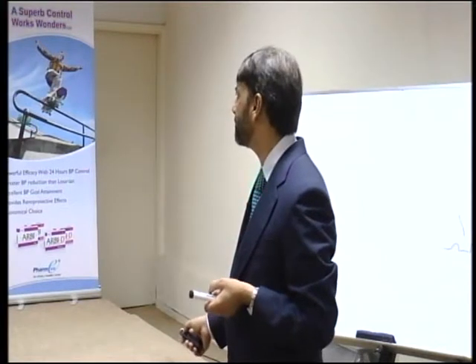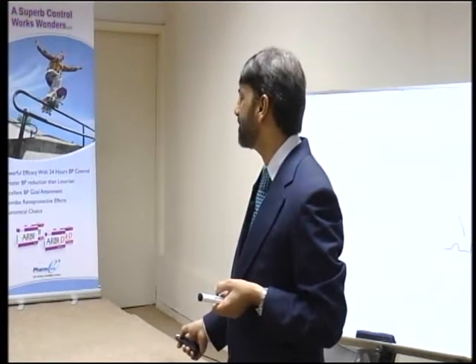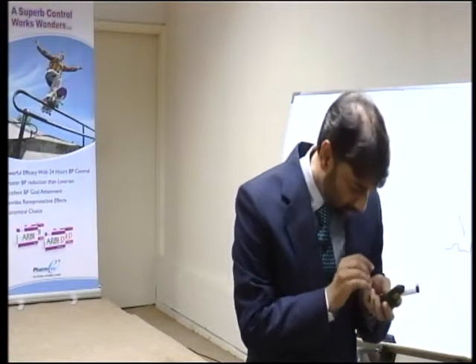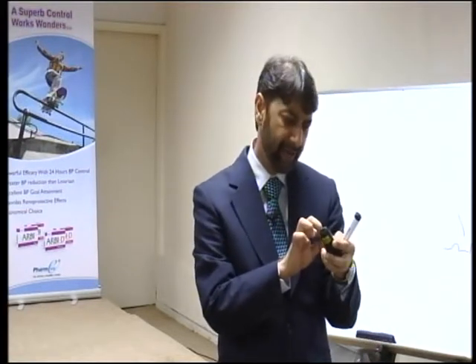This is the J point, where QRS ends and ST starts. That's the J point. Whenever you're seeing your ECG, try to stick, where's the J? Is the J at level, or is it elevated? The most difficult task is deciding where the QRS ends and where the ST starts. When you keep looking continuously, you will start getting an idea that this was the acute angulation part, it ended, and from here the ST starts.